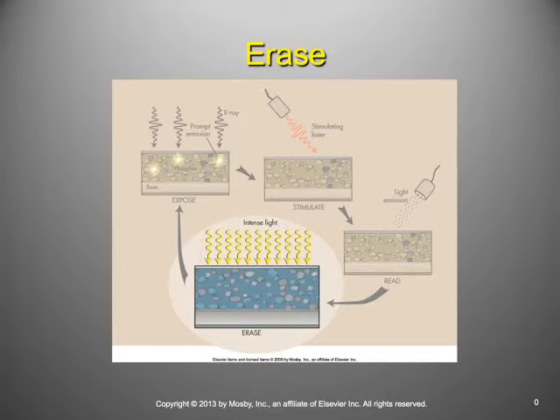It's going to turn on some very intense white light, and if there's any electron hanging out there, if there's any europium still in a metastable state, this exposure to intense light will cause it to be completely erased. Okay? So that is the final process, and it's best to use these image plates as soon as possible after this erasure, because again, they are very sensitive to radiation.